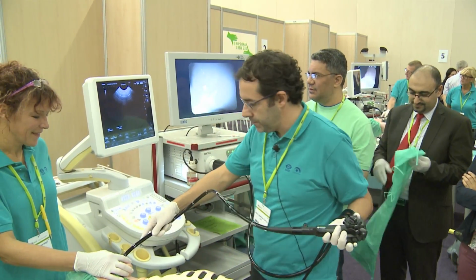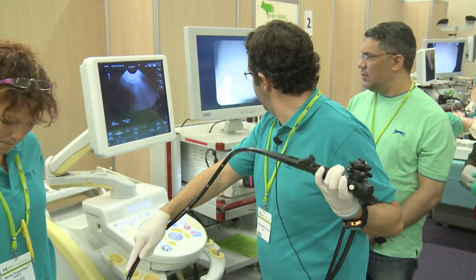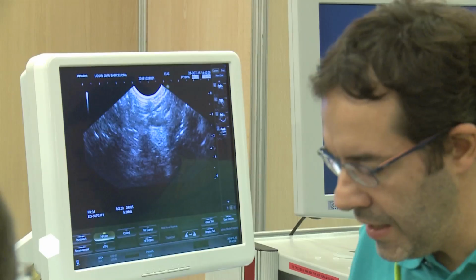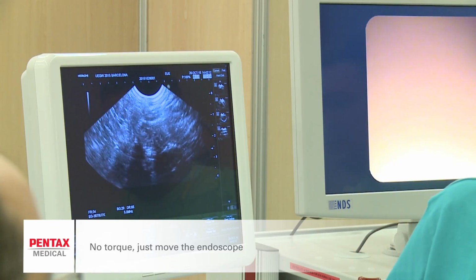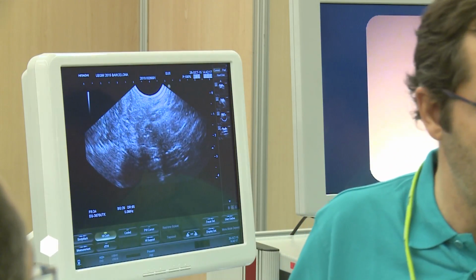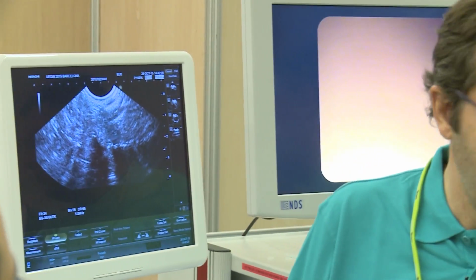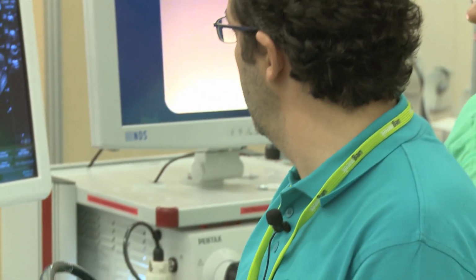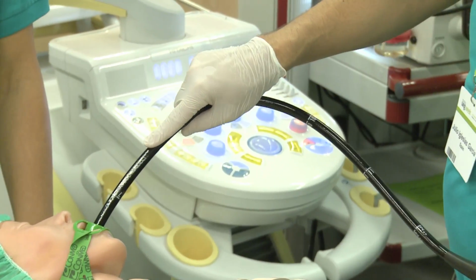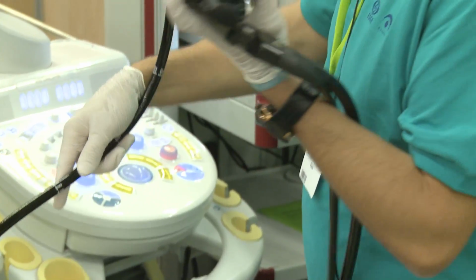Okay. So let's go. Another part of the technique that is very important for FNA, as you see, is that I'm not really torquing the scope at all. What I'm doing is just moving the complete scope. Okay, and that's another reason for FNA. One of the problems of FNA is that when you see the lesion, you need to have the scope as stable as possible, so as not to lose the position. And if you do too much torquing, you need your right hand to use the needle. So for instance, if we want to go for, let's try to find some of the lesions that might be... Okay.